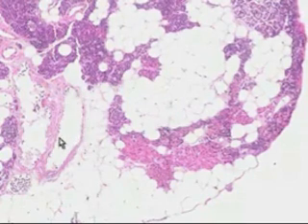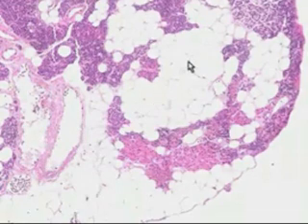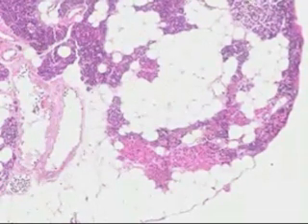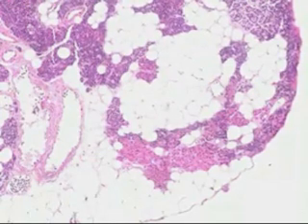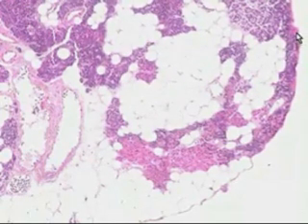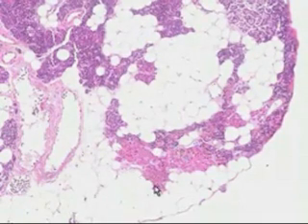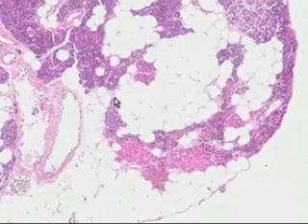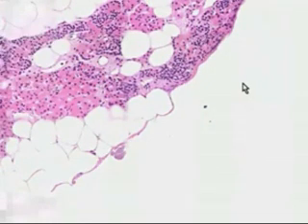Here's a nice good sized vein. Here's an artery. Here's another vein. Here's fat. Here's chief cells. There might be a couple little oxyphil cells scattered here and here and here and here and maybe here. Here might be a remnant of a capsule, and here's the largest group of oxyphil cells that you see in this particular gland. And let's zoom in on it, a couple more pops, and we'll see that clearly the oxyphil cells stand out like a sore thumb, because they are very red.